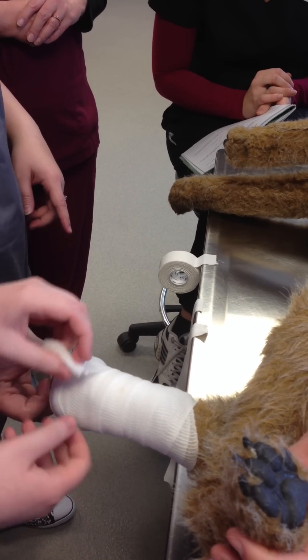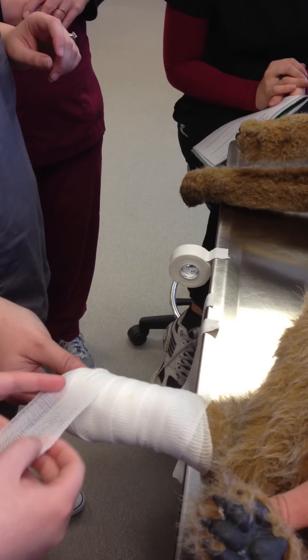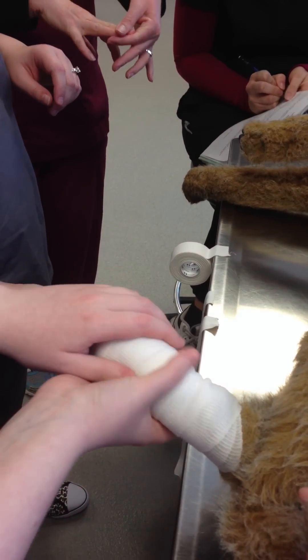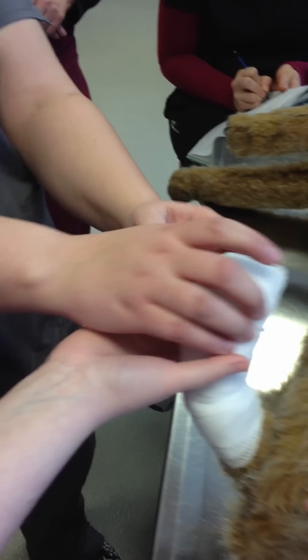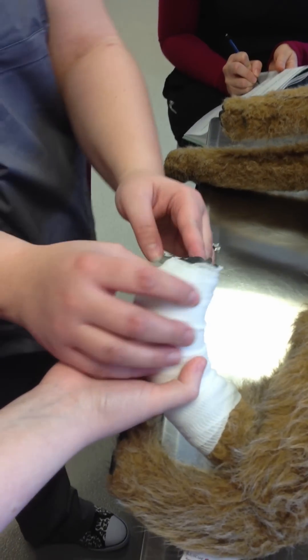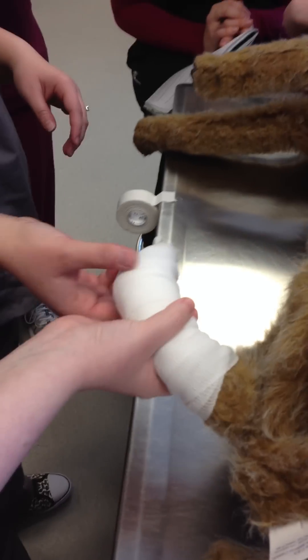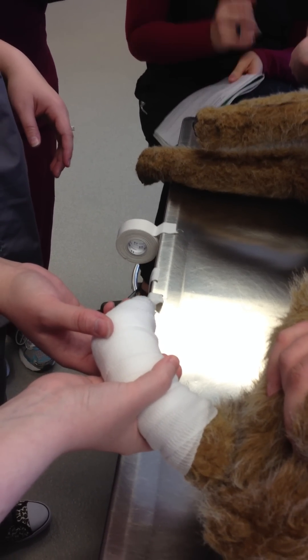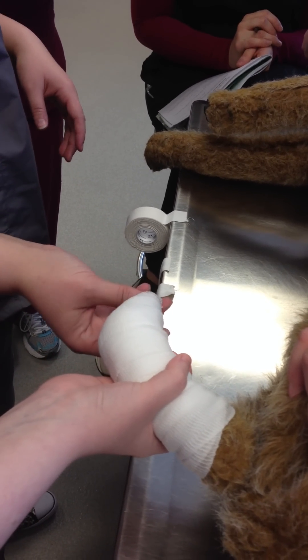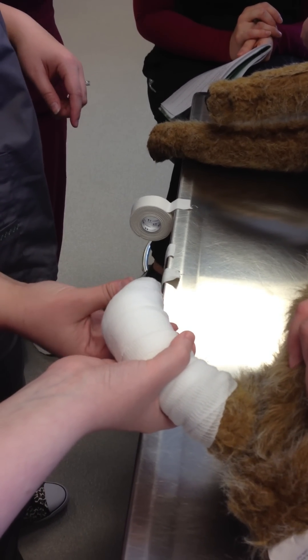We have a choice when we do these bandages to include the toes or not. If we follow bandaging conventions, we'll include the toes and only leave the very tips of the toes out, so you're not going to be worried about puffy paw. When we would do these bandages, we would only go as far as the knuckle — just enough to cover the incision — but the technicians had to be really good and get the tension just right so we didn't get puffy paw. So they're breaking convention by not going down to the toes.